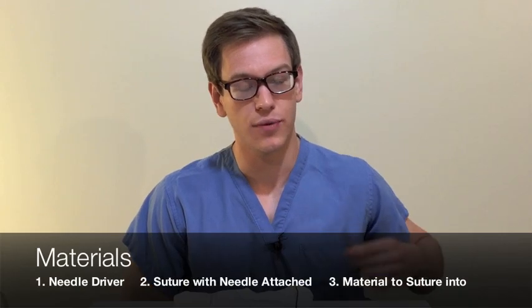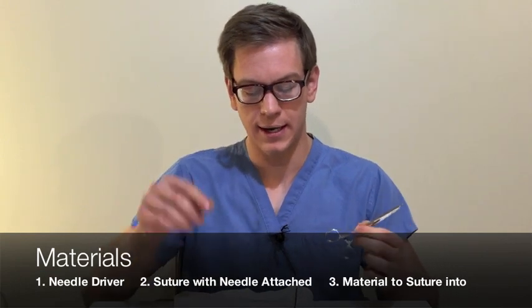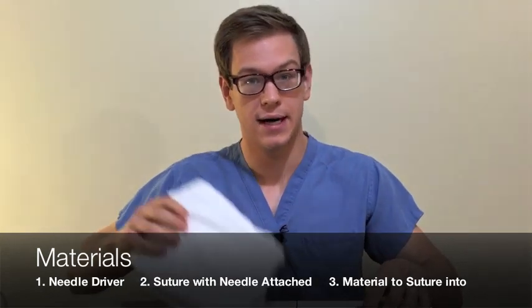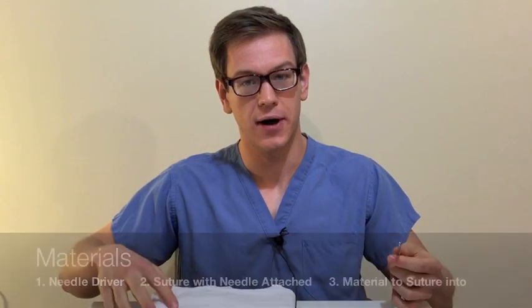The materials that you'll need to follow along with the video — you're only going to need three things: a needle driver, a suture with a needle on the end, and something to sew into. I'm just using a rolled-up white t-shirt because it shows up better on the video.